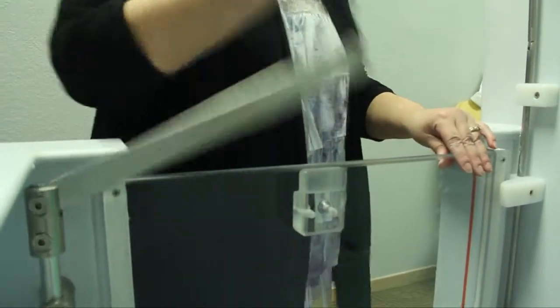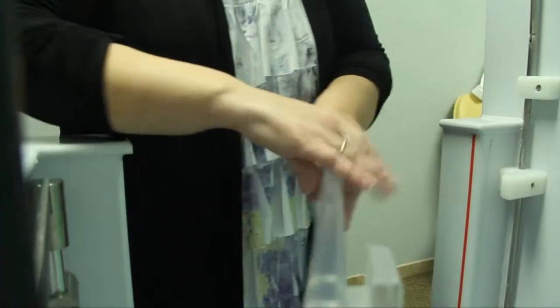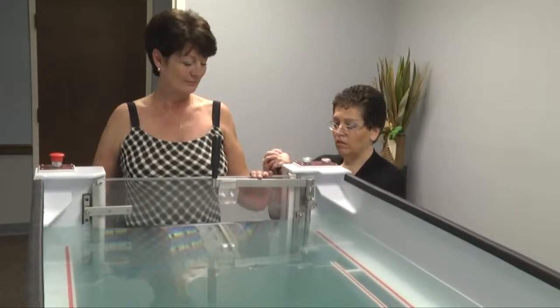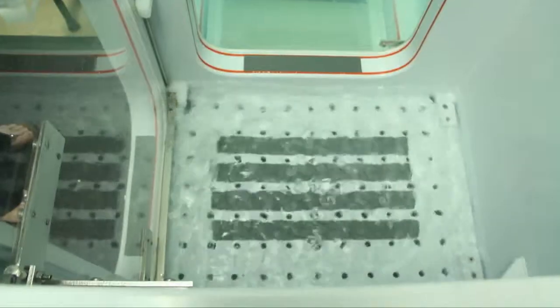You open up the foyer door, allow the patient access to the foyer, you close the door behind them, locking them in, then you open the valve which allows the water to flow from the main tank into the foyer.